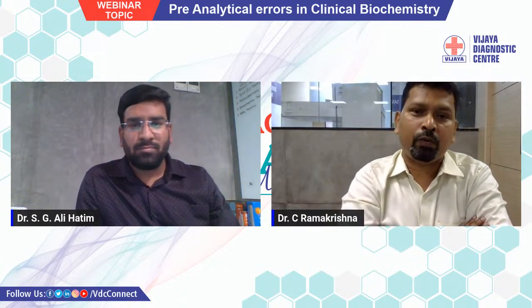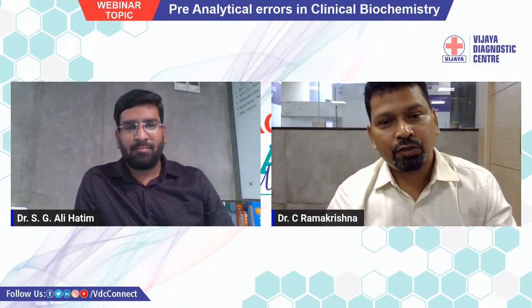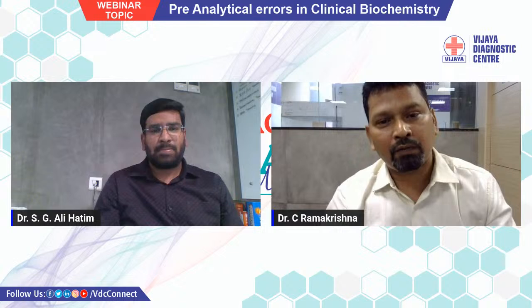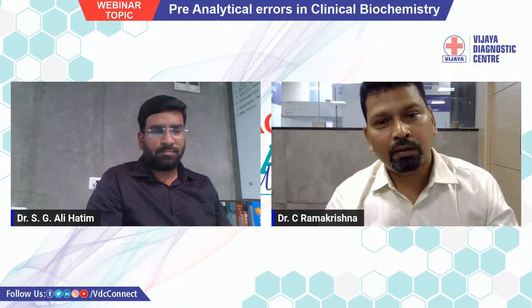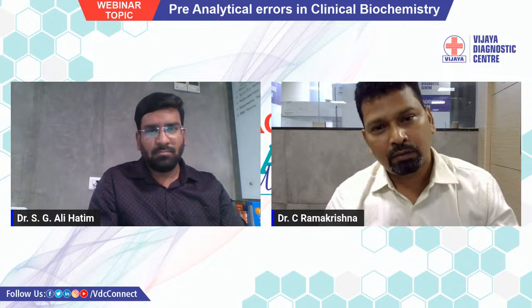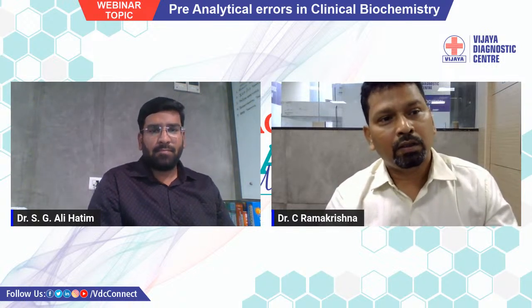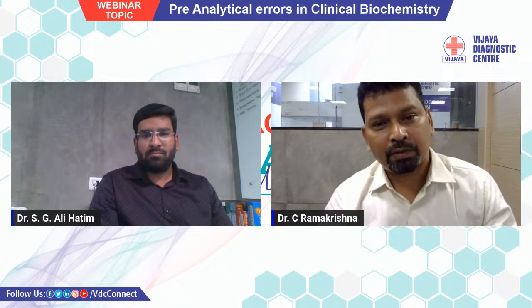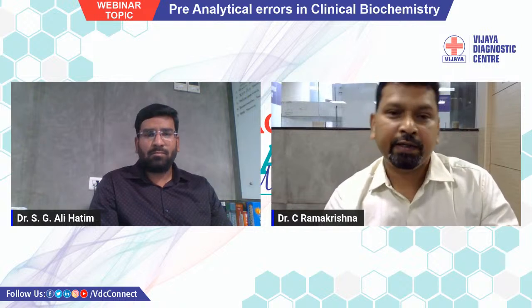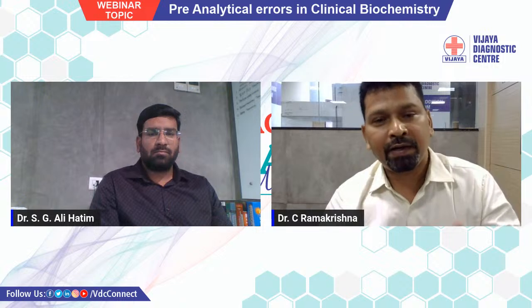Yeah, so that is very important because the sample needs to be mixed with the additives, and this should be done immediately after taking the sample, right? And it should be done according to the type of sample collected. For example, the fluoride should be mixed 8 to 10 times, inverted 180 degrees and then back to the upright position 8 to 10 times.